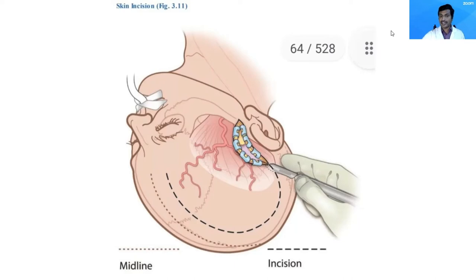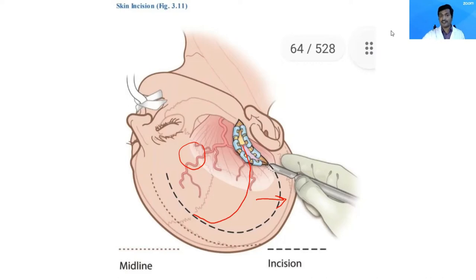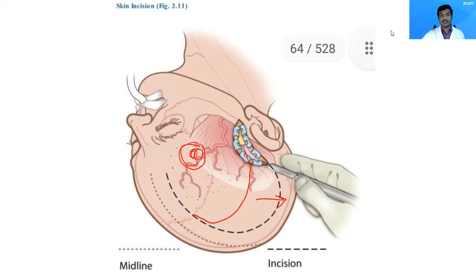Depending on the incision, you can tailor the posterior extent of the flap. For a lateral frontal contusion, the flap needn't be so large. When deciding the extent of the flap, you should take into consideration the location and volume of the frontal contusion, and also the location of the edema around the contusion. The flap should encompass the combined volume of the contusion along with the pericontusional edema.